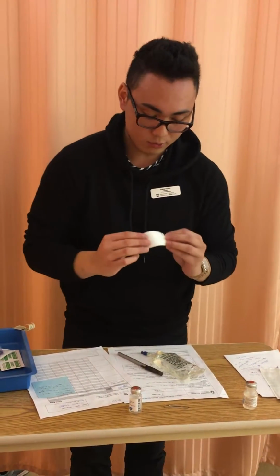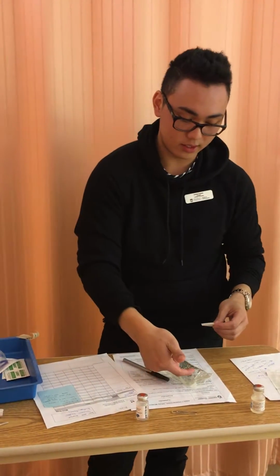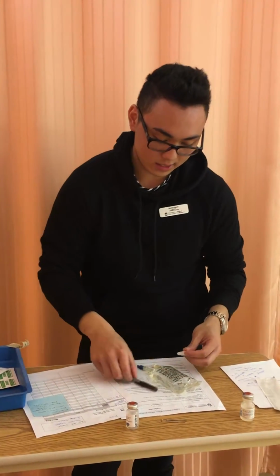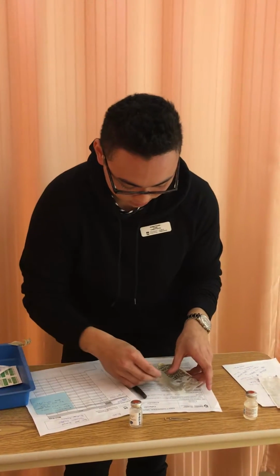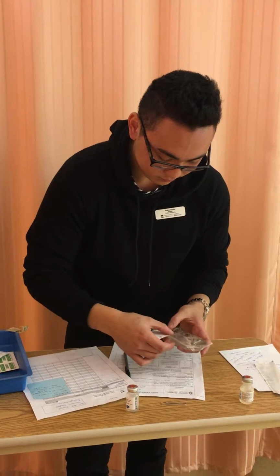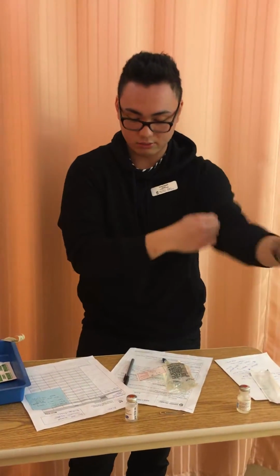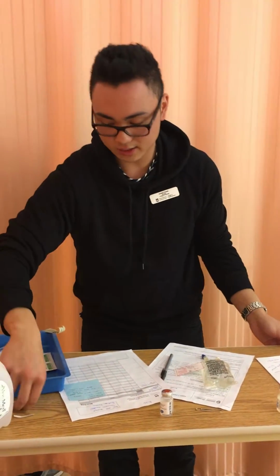signature. And when I place this label on the bag, I have to make sure that I'm not covering any parts of the bag that has any information on it. So just put it on the side here. Okay. And now we are ready to go to bedside. So yeah, again, I'll bring in the needle.